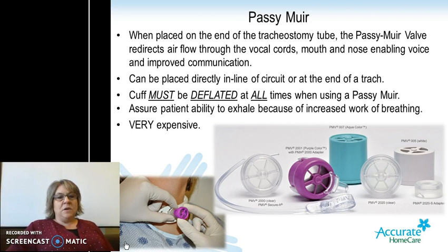Keep in mind a very important part of this Passy-Muir valve is if your client has a cuff on their trach, it must be deflated at all times when using the Passy-Muir valve. Otherwise, the patient will not be able to exhale. You have to assure the patient's ability to exhale because of increased work of breathing when you place one of these valves on the end of their trach. These are also very expensive, so please make sure you take good care of them.